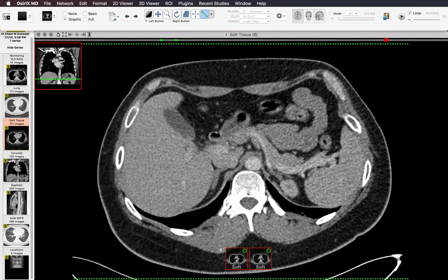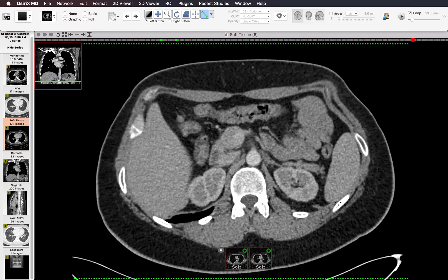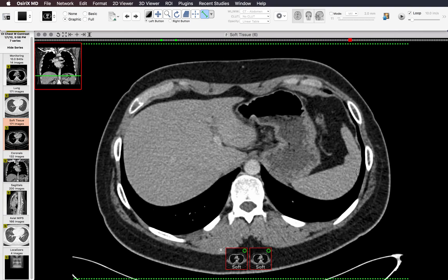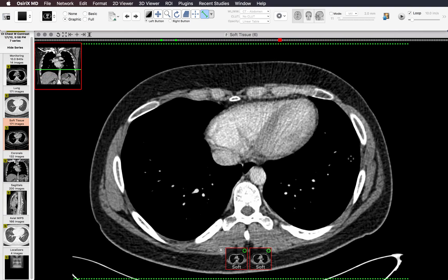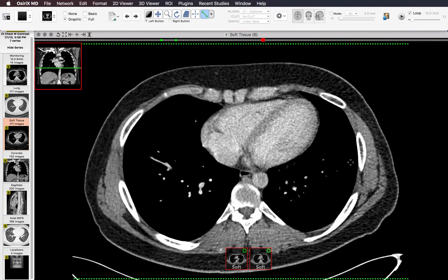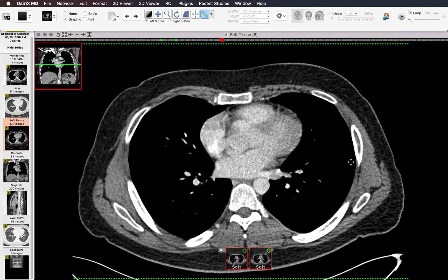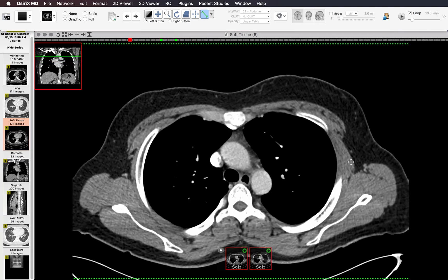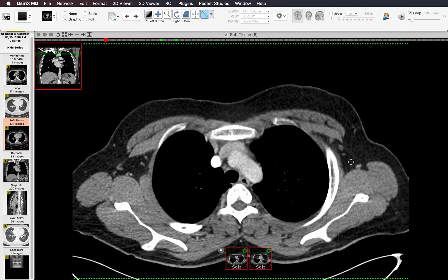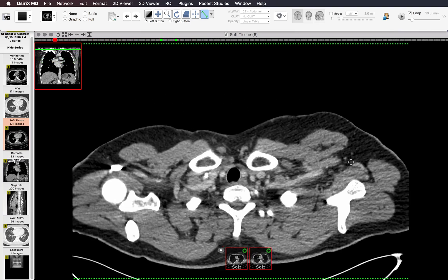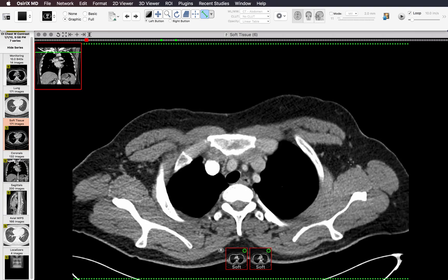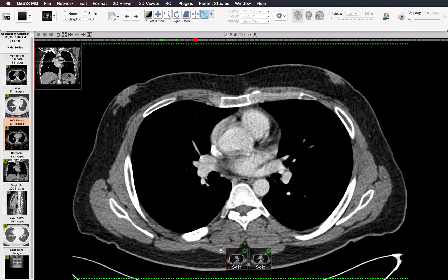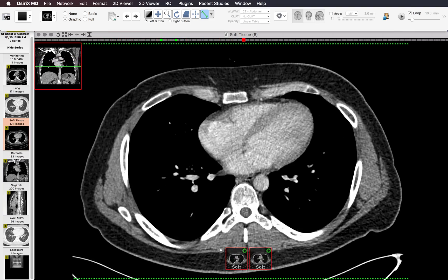Next I look at the pleural surfaces on soft tissue windows, looking mainly for pleural effusions, pleural nodules, thickening, or pleural calcification. We'll have another chance to look at the pleura on lung windows, but I like to look at it first on soft tissue windows before moving on.